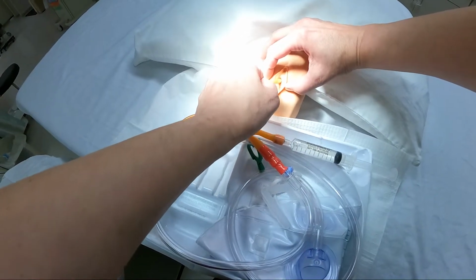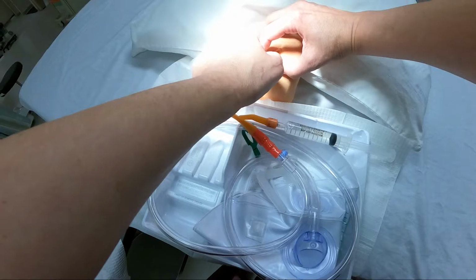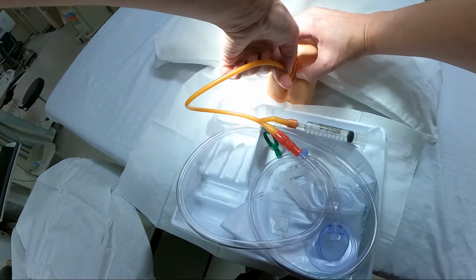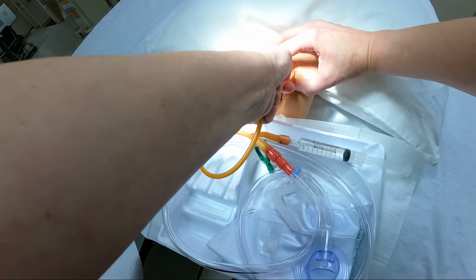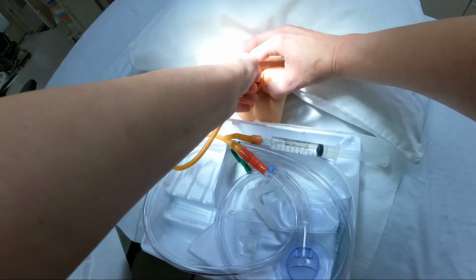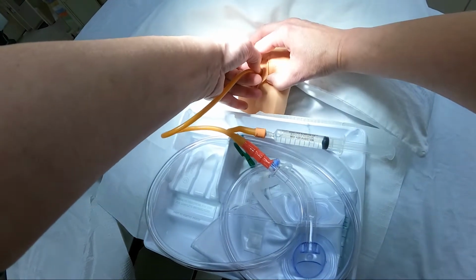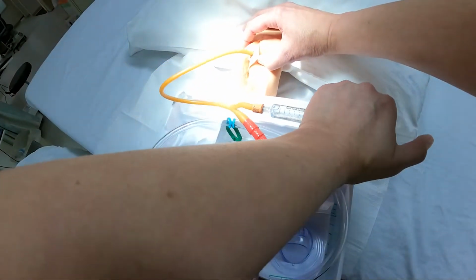There we go. So then you would carefully insert, making sure that you're not dangling the catheter over, because you have to be mindful of where the rest of that catheter is. And if you over-lubricate it, it's going to take a minute for you to actually see a urinary return. But in women, once you see the urine coming back, you can stop, because you don't really need to go to their tonsils with it. And then once you're there, inflate the balloon.